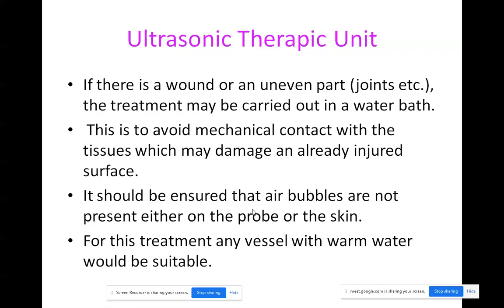Or if there is a wound, wound means an injury. In that case the treatment may be carried out in a water bath.